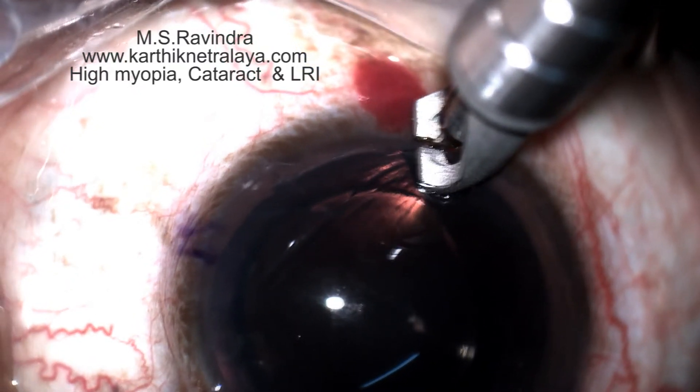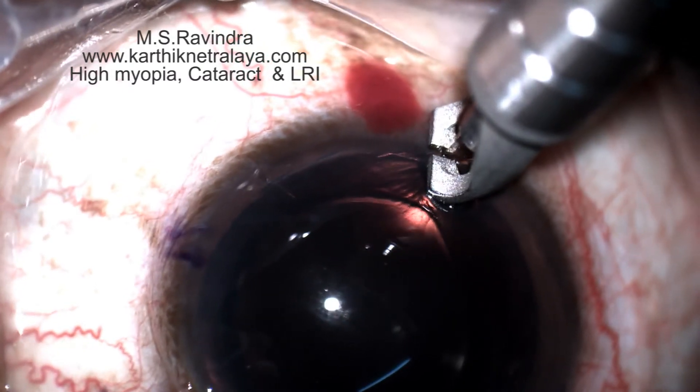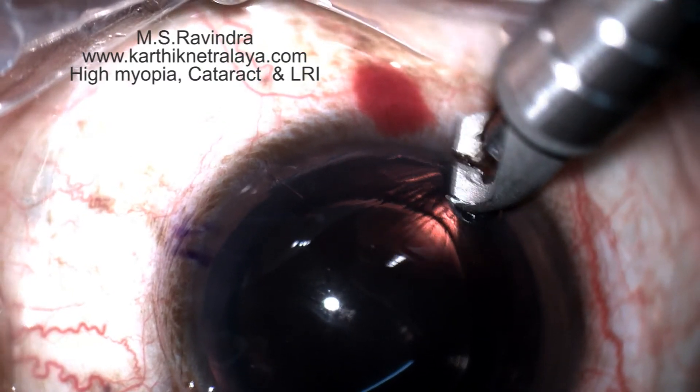The upper tunnel incision and inferior LRI together will give a relaxation of the steep meridian by about two diopters.